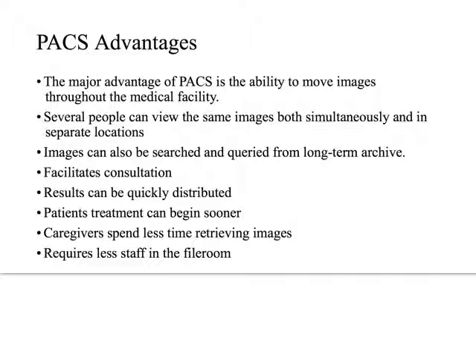So what are some advantages of the system? And I actually had the misfortune to work at one point in time in a film library, and it was miserable to sort through films, to file, for example, a study and then have to file the report later on, or this doctor needs this report or this study and some other doctor has this report or this study.